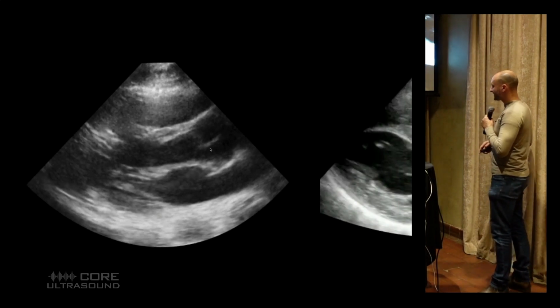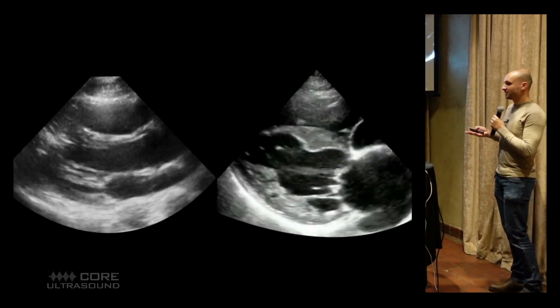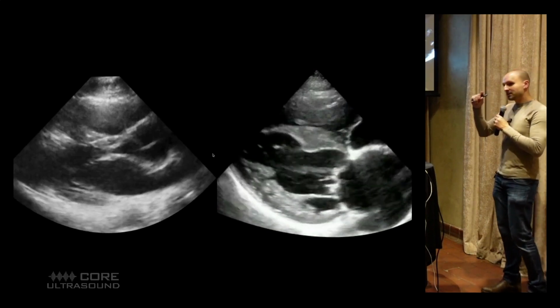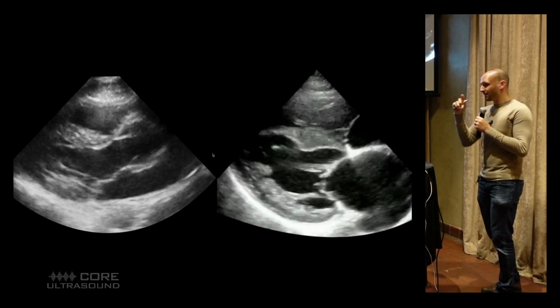Now, let's compare this guy to this guy over here. So looking at it right off the bat, it looks like it's a low EF, right? I want you to focus first on this right here. So this is the septal wall. You see how it's getting bigger and smaller? You might have to focus on it a little bit, but it is changing its diameter.